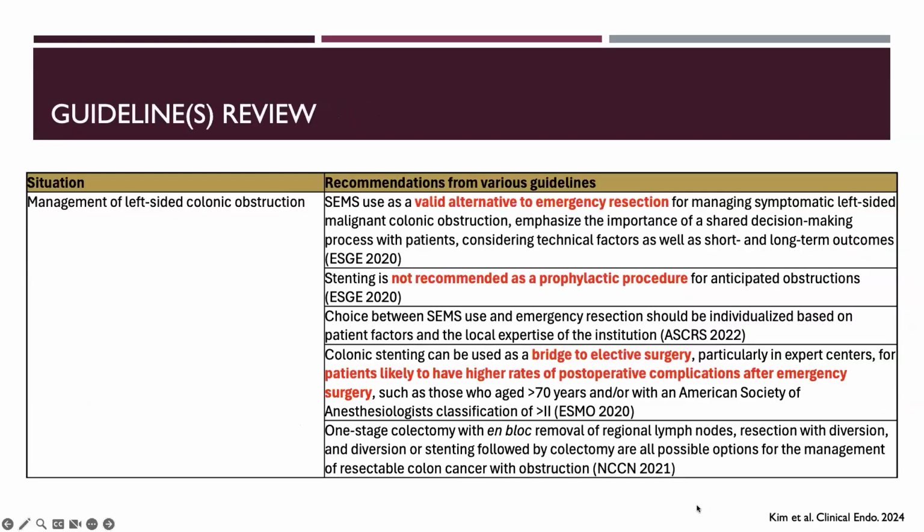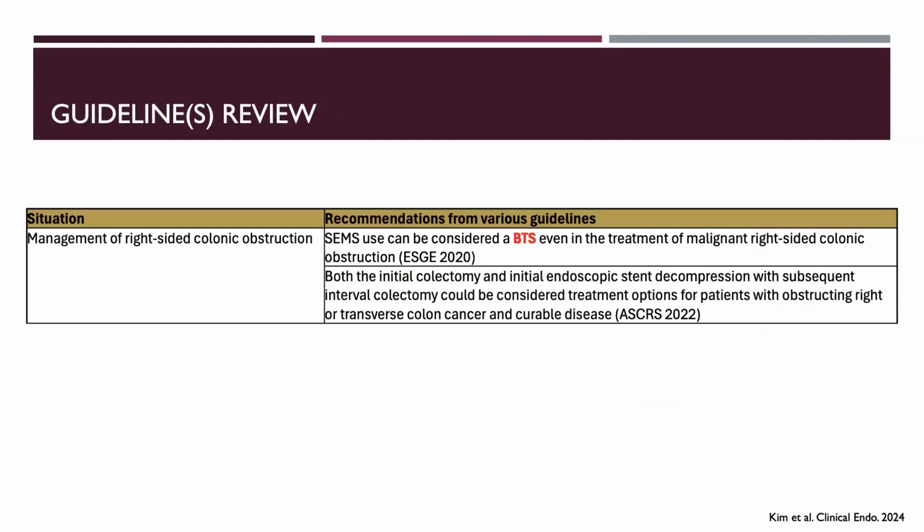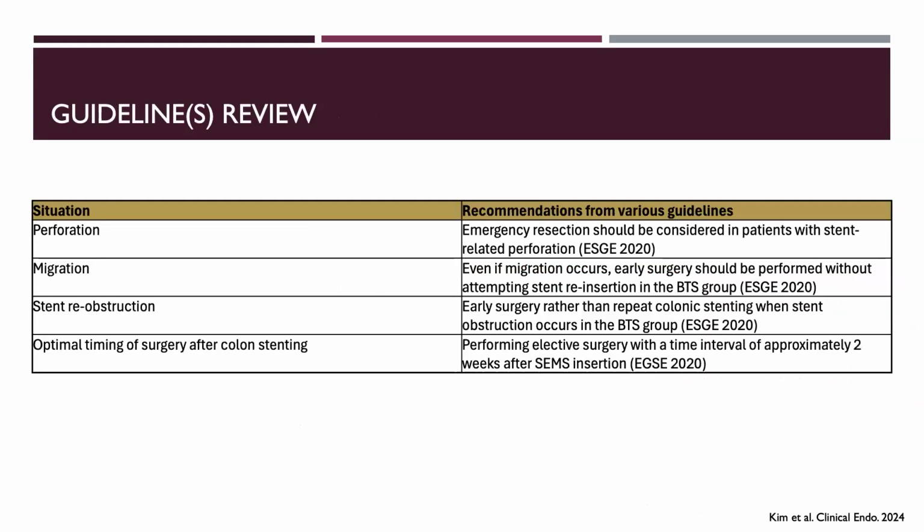These are the last bit of slides I just wanted to put in here. I'm not necessarily going to go through them because I want to leave some time for questions, but these are the guidelines review of what to do in certain settings. So these are guidelines for left-sided colonic obstructions. I'll just leave that up here for a second. This is for right-sided colonic obstructions. Again, these have your ESGE guidelines and other guidelines, CRS guidelines. And then your guidelines related to perforation, migration, stent reobstruction, and timing to colonic surgery.